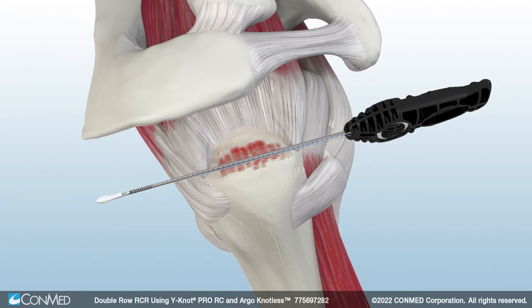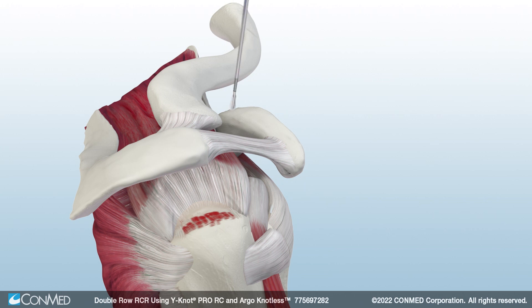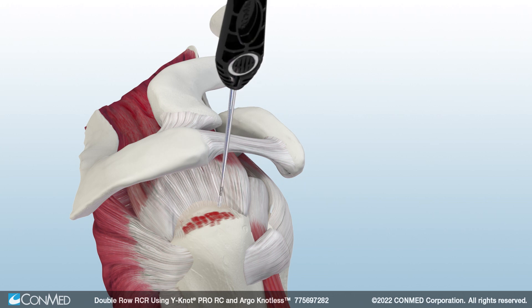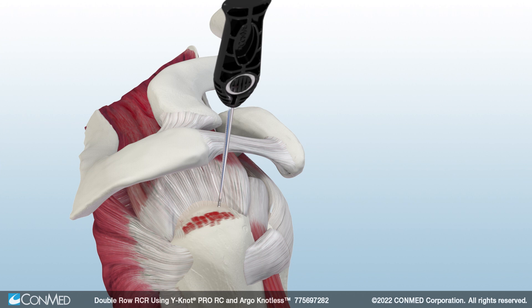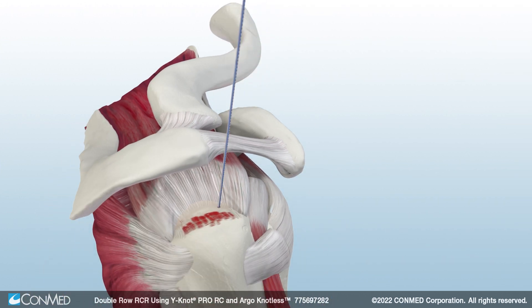To begin, insert the Y-Knot Pro RC with Hi-Fi Ribbon at the anterior insertion site of the footprint. Mallet the self-punching anchor into bone until, at the very least, the first laser line has been reached. The anchor features a cleatless delivery system. Simply pull back firmly on the driver handle to unwind the sutures and remove the driver. Then pull back on all the suture limbs to confirm anchor fixation and deploy the anchor.